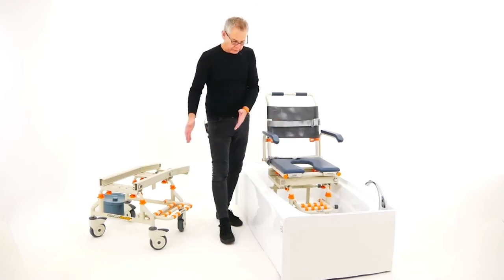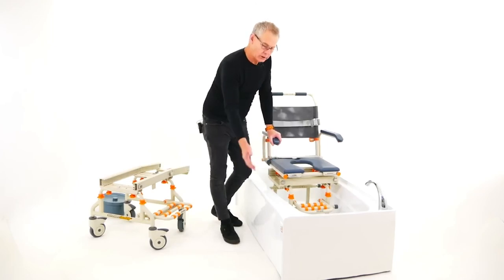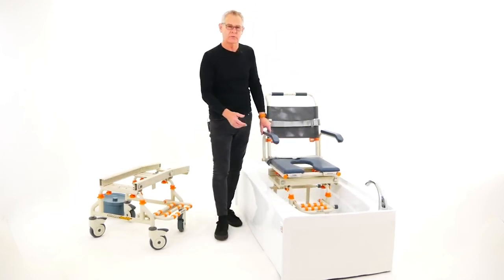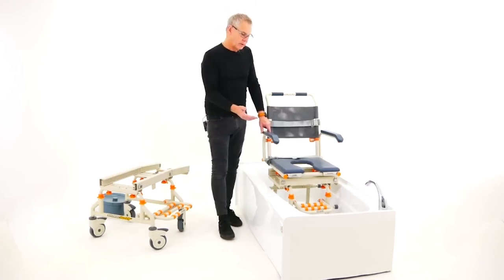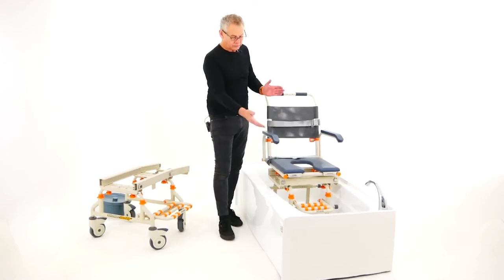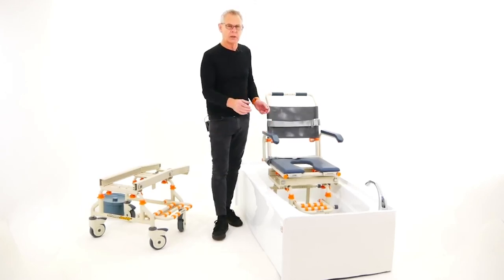In this model, the caregiver assists by lifting the user's legs up and across to the footrest during transfer. There is also a Tub Buddy Tilt model, which you can research on our website, that will tilt the user so you don't have to lift the legs. It's in a different price category and slightly smaller, so it suits some bathrooms that the tilt model may not.